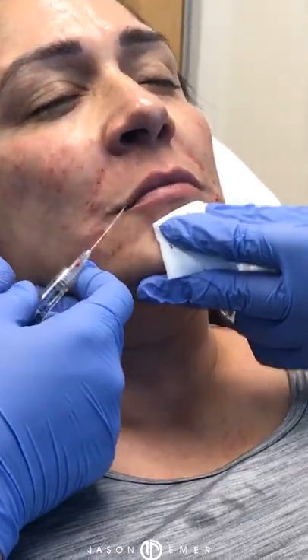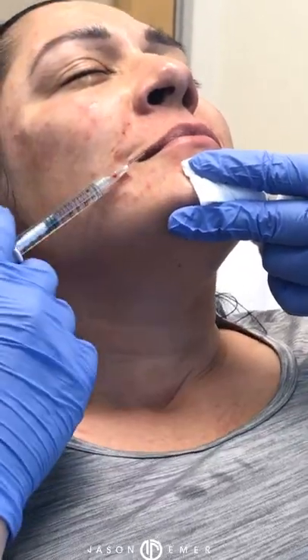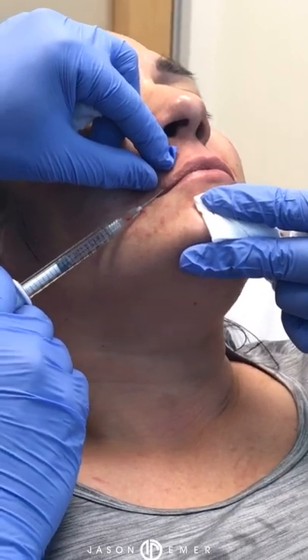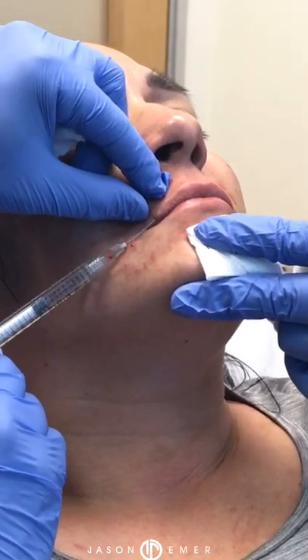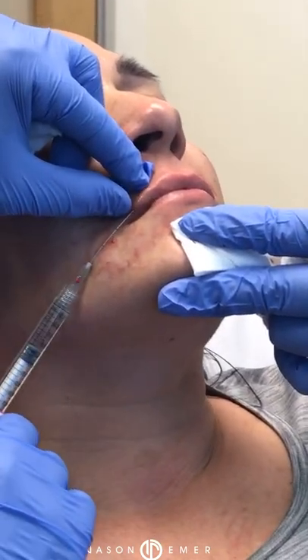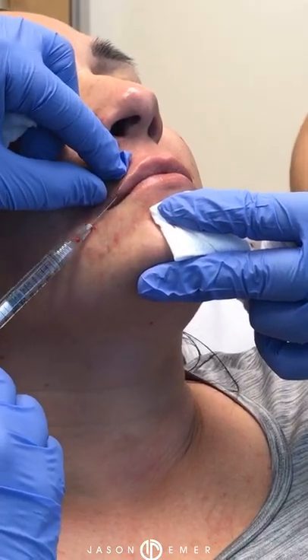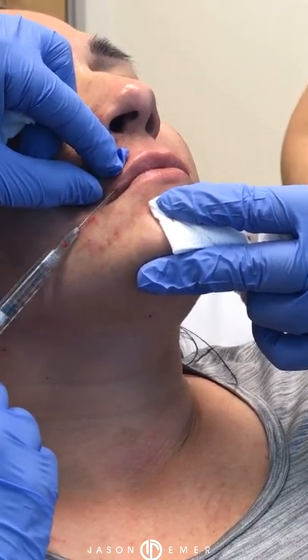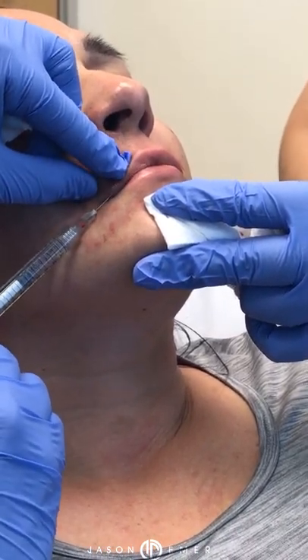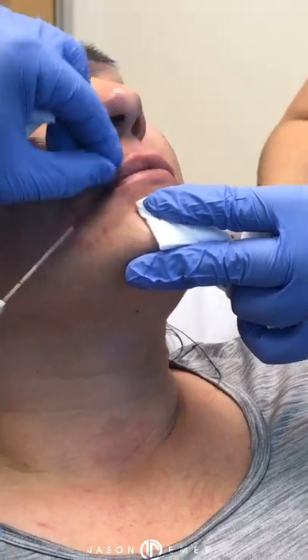Look all the way up with your chin and look to the left a little bit. And really quick, 1, 2, 3, good. Right here, we're at the Cupid's bow and really soft. It's always that initial poke. Never feels that great. But I'm only doing a little, and look at just that little bit, that little plump. See here? I'm going right up in the Cupid's bow. Okay. Good. So right there, we're done.